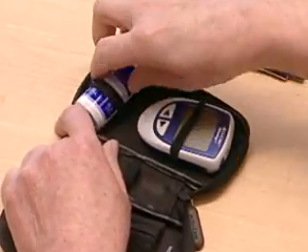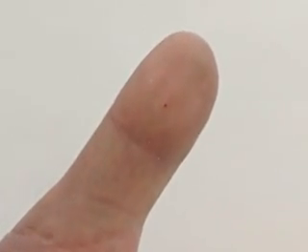Some glucose meters allow you to use blood from places other than the fingertips, such as the upper arm, the forearm, the base of the thumb or the thigh. This can give you more options, but blood from a finger stick shows changes in glucose levels more quickly than blood from other parts of the body. That means that glucose levels from these other places may not always be as accurate as readings from the fingertips, particularly when glucose levels are changing rapidly.